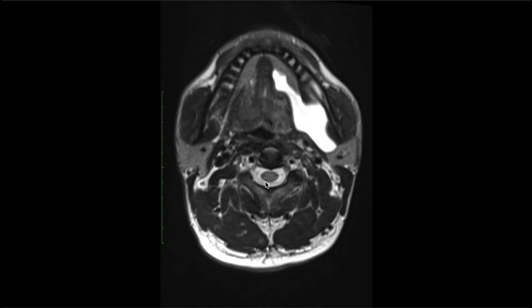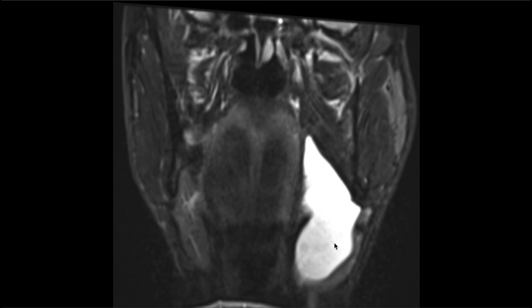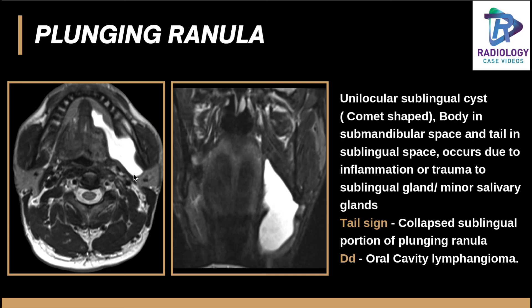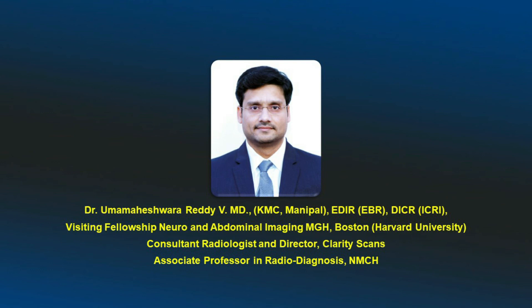Coming to the last case: this is a classical cystic lesion on axial T2 imaging — a case of ranula. A tail sign is appreciated, which represents an enlarged submandibular component of the lesion and a tail-shaped sublingual space component. This is classical in cases of plunging ranula. Differential diagnoses include oral cavity lymphangioma. Whenever you see this comet-shaped lesion or a classical tail sign, you can confidently diagnose a plunging ranula. Thank you very much — hope these cases were useful.